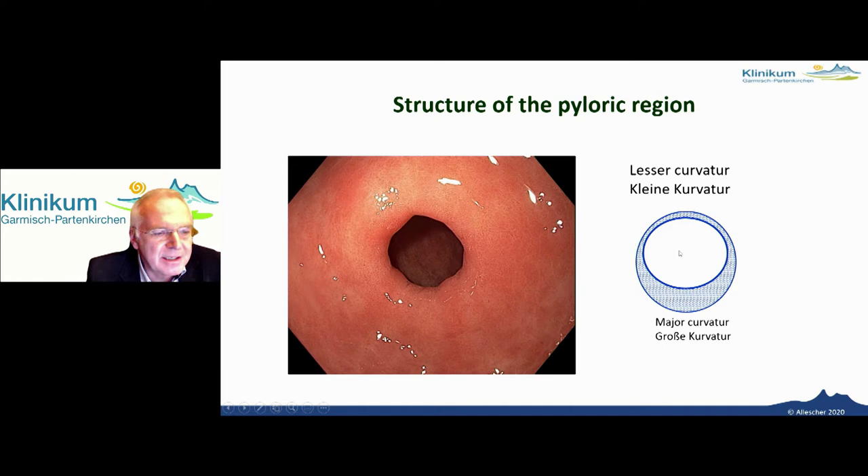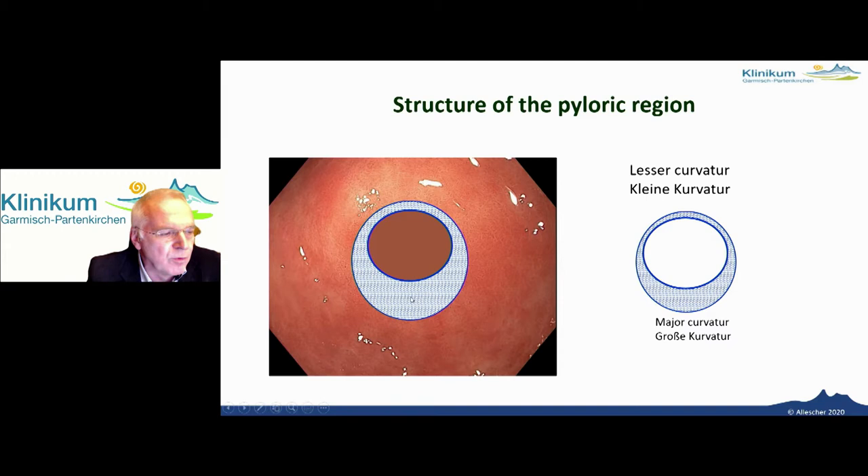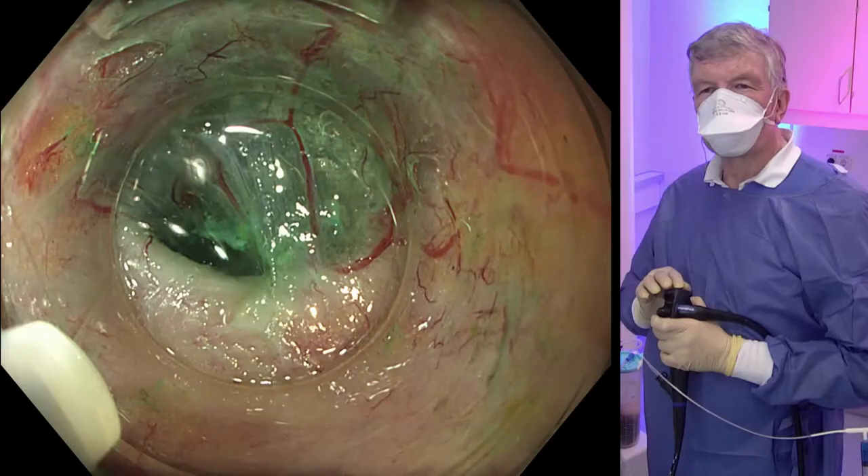Here we see the pyloric muscle. It's not homogeneous, it's not roundish. The main part is at the major curvature. Therefore, it makes sense to do the POEM cutting at this side of the gastric stomach, as you can see here.